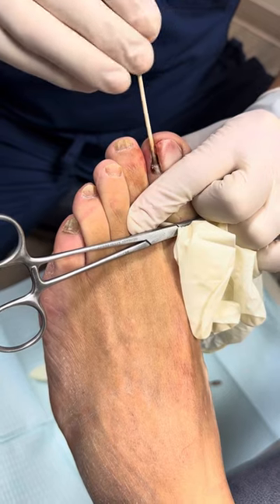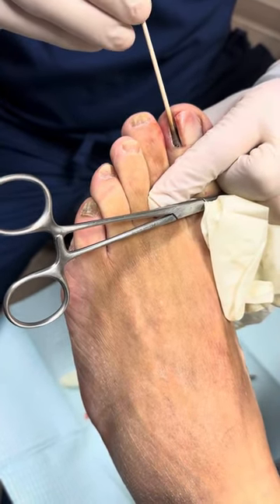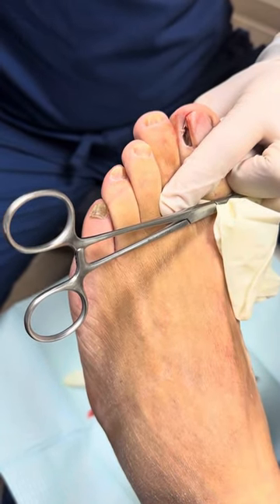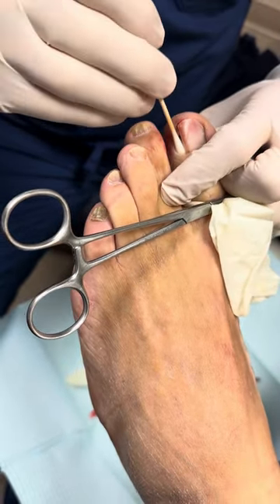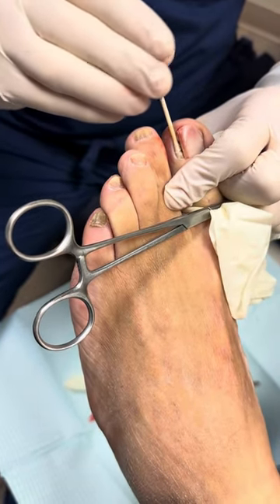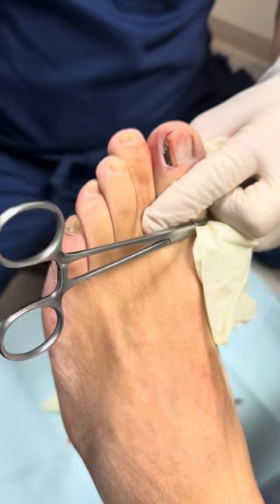You can see the tissue on the skin is getting a little white — that's from the acid. Patients need to be informed that after this procedure it's going to get red, because we're purposely burning the nail so it doesn't grow back. What happens when you have a burn? It blisters or it drains. So one of the big risk factors for this procedure is infection — if they don't clean it out properly, nails harbor a lot of bacteria. We're just twirling the Q-tip with the acid, and this will also stop bleeding on the nail bed.